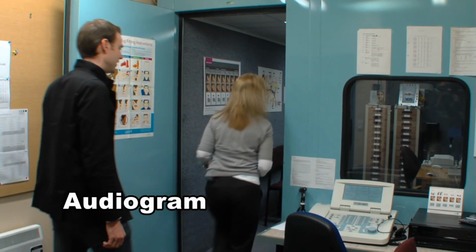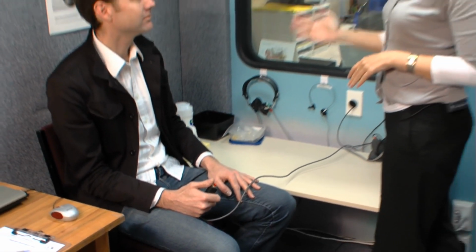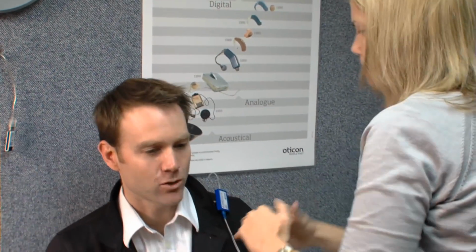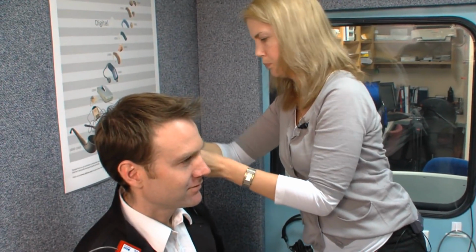Now for the audiogram. Here we go, just have a seat there. So I'll just give you that button there. Great. So what's going to happen is I'm going to put some headphones in your ears and you'll hear beeps in one ear at a time. So whenever you hear a beep, you're just going to press that red button, even if it's very soft. Okay? I'm just going to put these in your ears. These are right clipped onto your jacket? Yeah, sure. Okay, so it just sort of goes in your ear like a foam earplug.